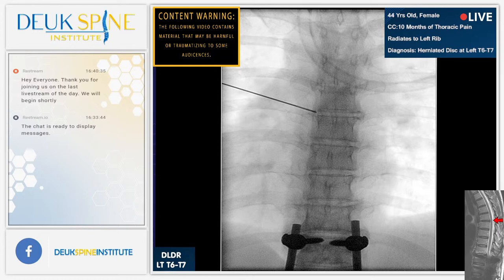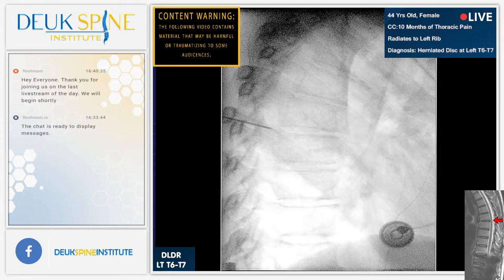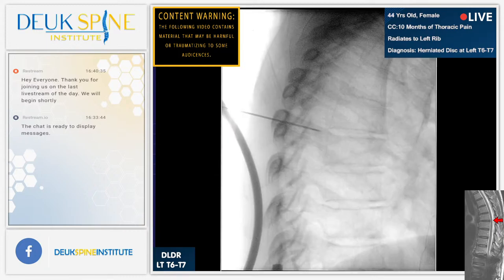And again, we're going to fix a thoracic disc herniation, something that no other surgeon will treat because it's too risky to do with open surgery. They have to take the rib out. They have to do crazy things. We call it lateral extracavitary surgery, which you don't want to do on somebody, not for back pain.